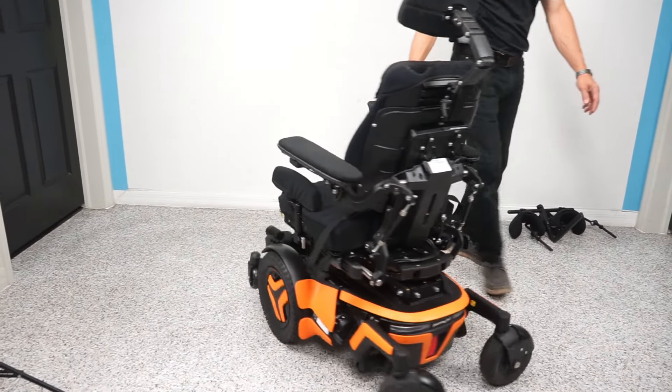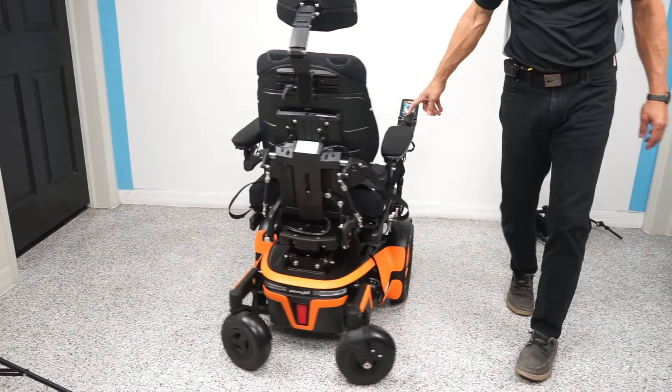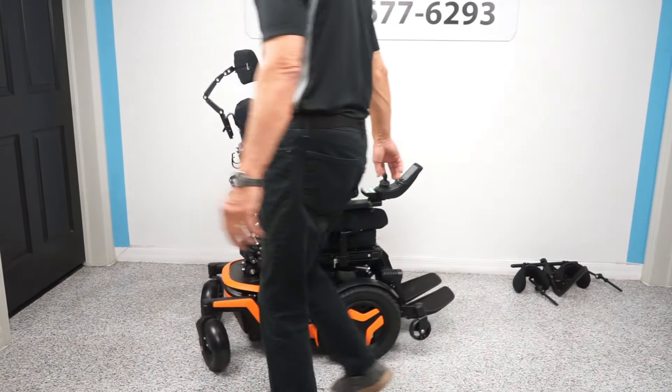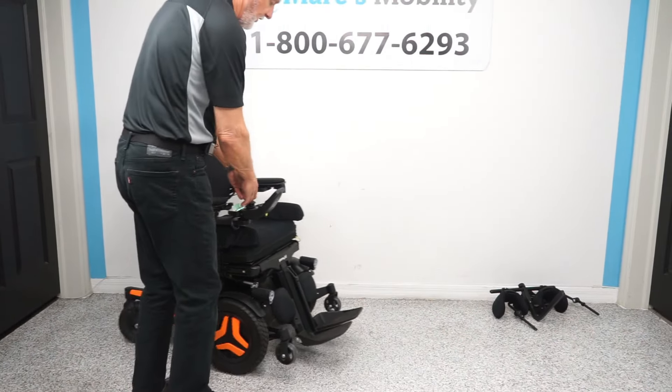We're going to turn around and show you how easy this chair turns in a circle. So this is how it turns — if you have it in your house, you can see how quiet this chair is. That's your turning circle.